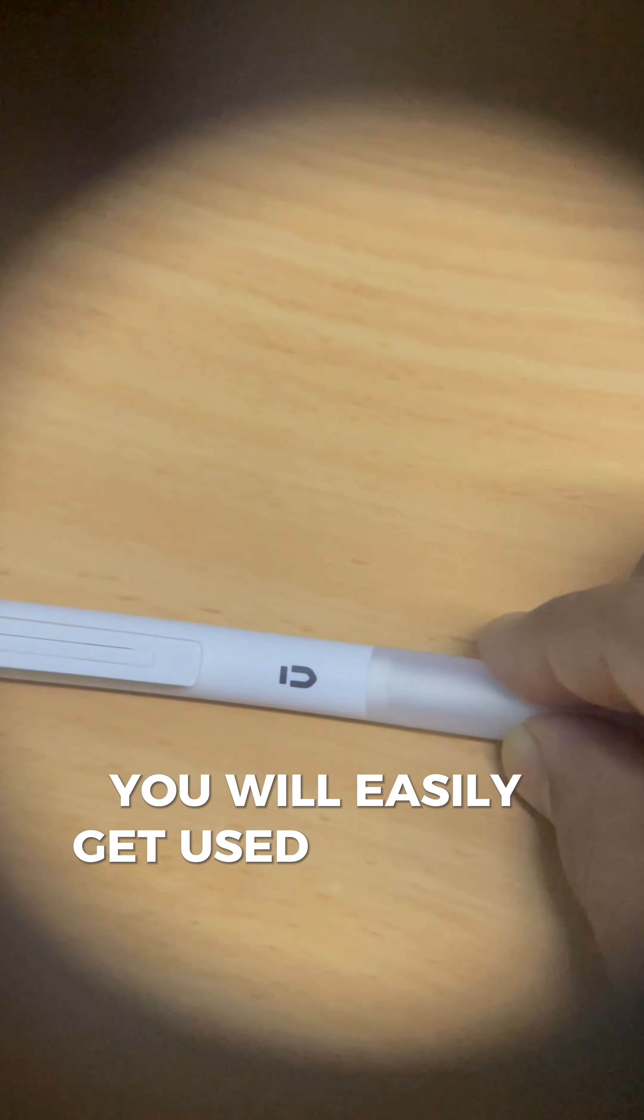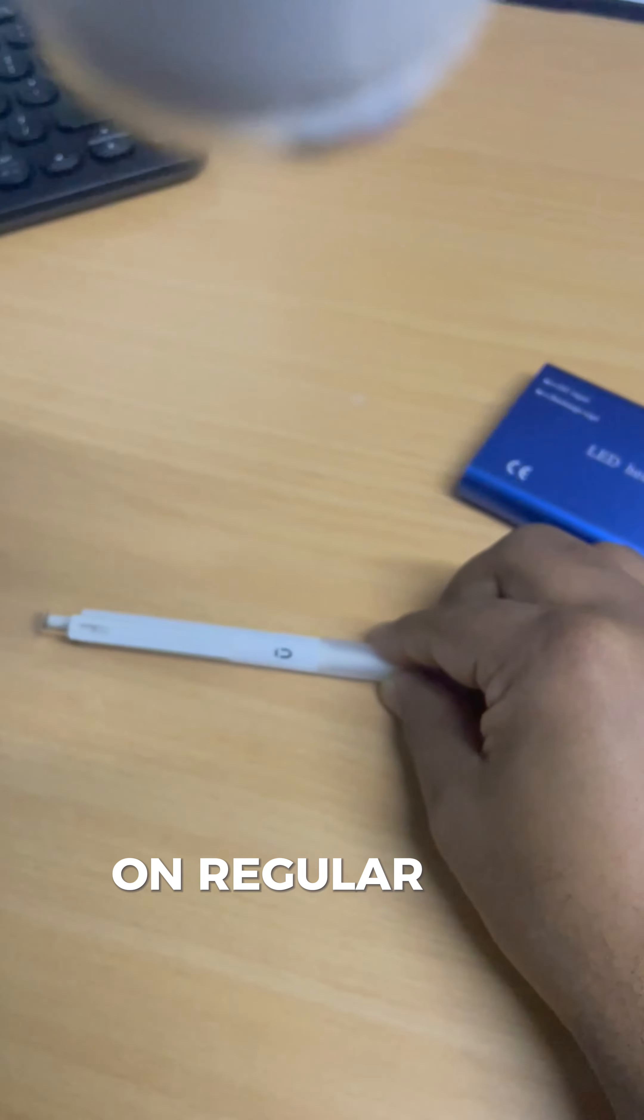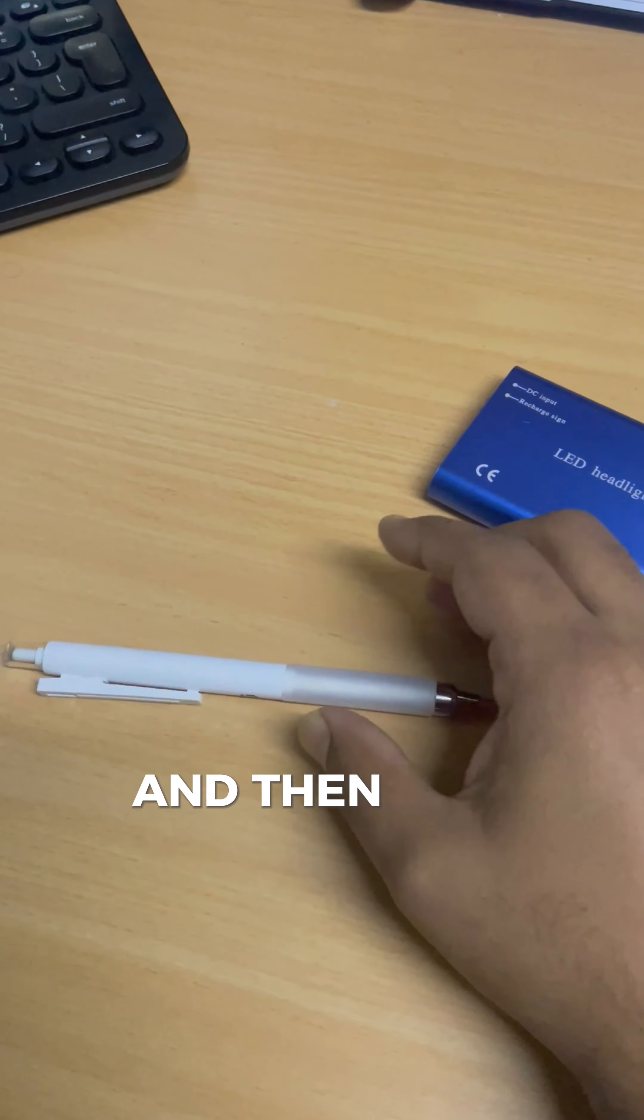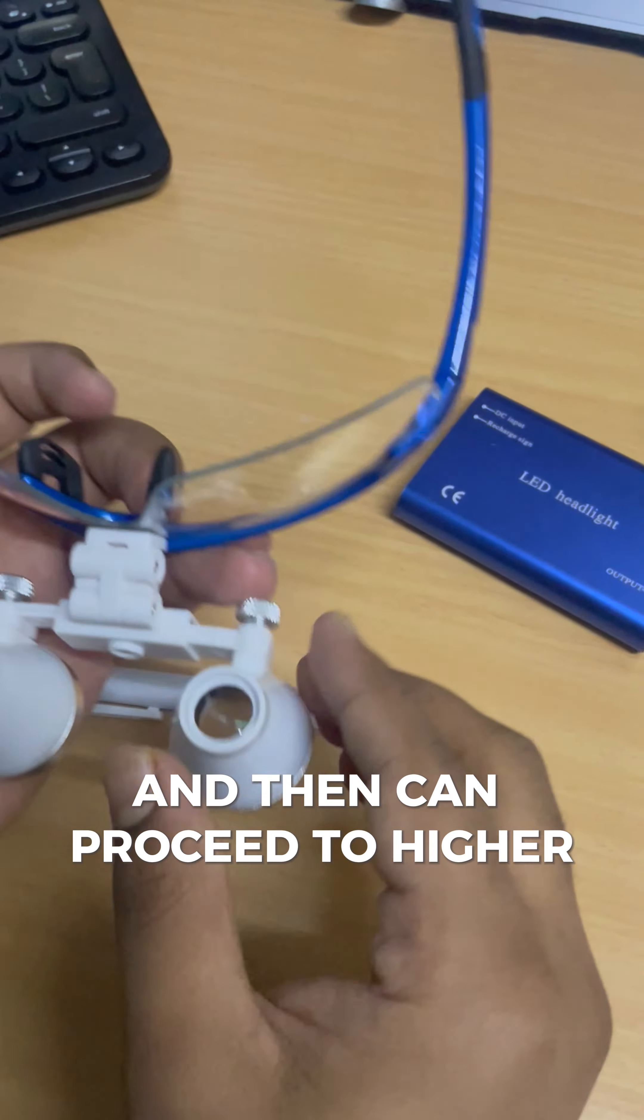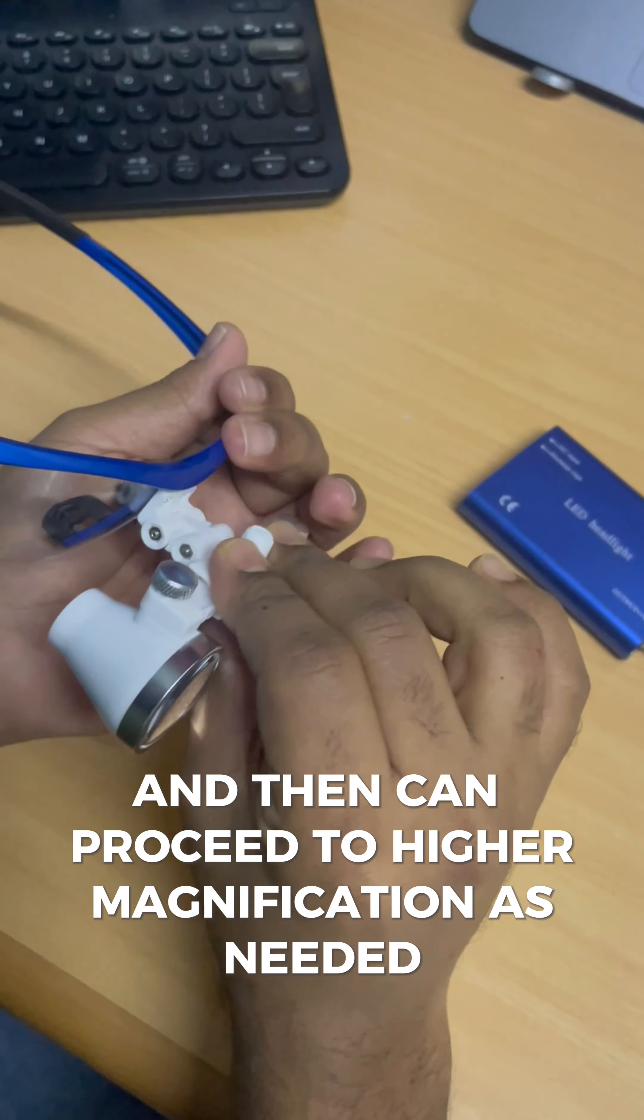You will easily get used to this in a few months time on regular use and then can proceed to higher magnification as needed.